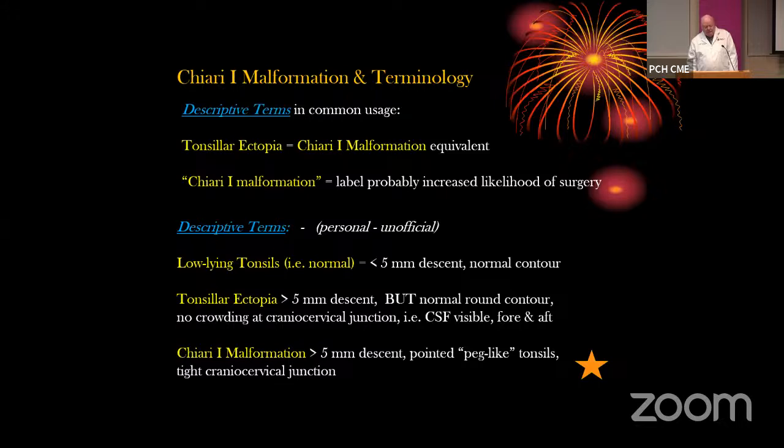Don't call a Chiari-1 malformation unless you have a really solid Chiari malformation, because unfortunately there are people, mostly not pediatric neurosurgeons, who will leap in and do surgery for Chiari-1 malformation when really there aren't the symptoms or indeed the imaging findings to really justify that. So here's my personal way of describing things.